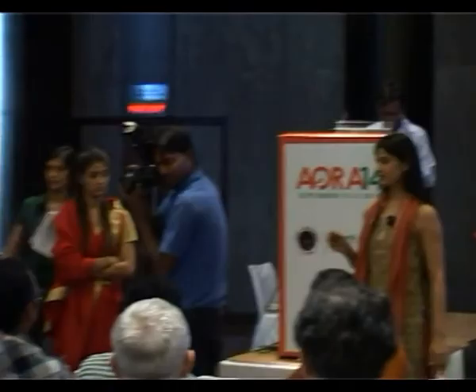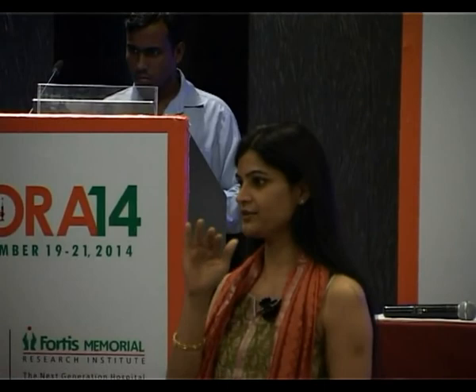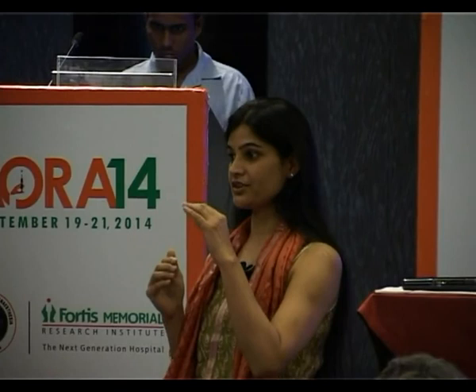I wanted to ask Rani if you could just describe your technique, if we have time, for putting in the fascia iliaca block. So it's like you do a femoral nerve block. You start to identify the femoral artery. You see a sharp bright line. If I can have that slide back on. The sharp bright line you see is the fascia lata, and just below that you see a second line which is not as sharp as the lata. That's the iliaca. And below that you see the femoral nerve.